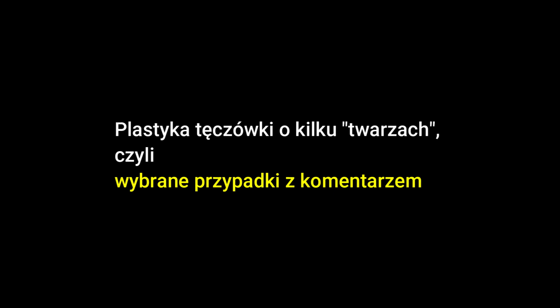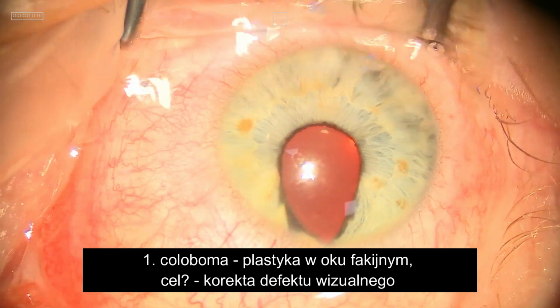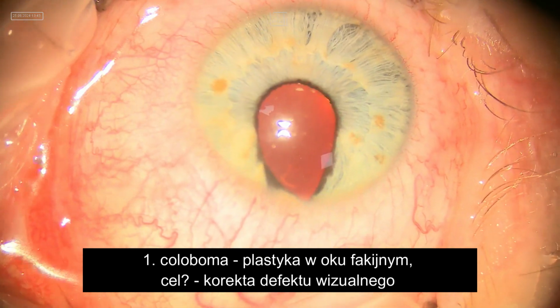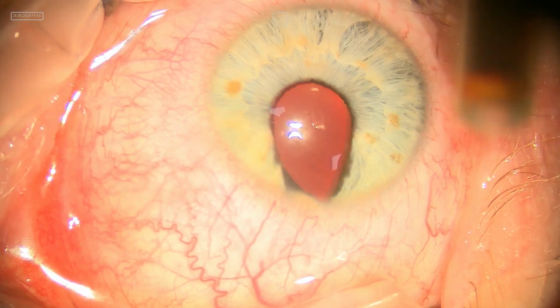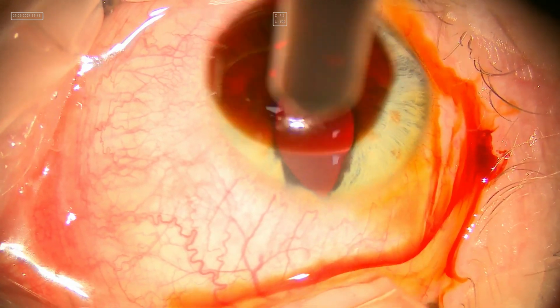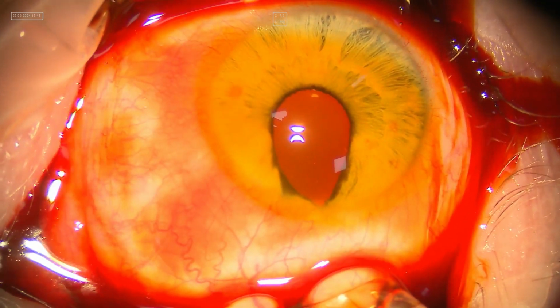Dear watchers, let me share with you my latest movie. During it, I want to share with you my experience in repairing problems with the pupil. The first case is the congenital coloboma.